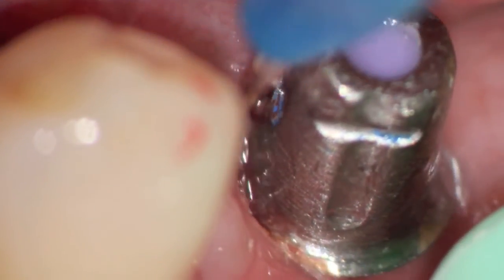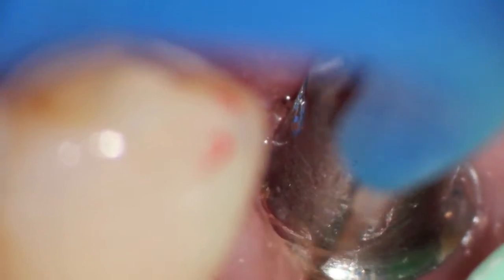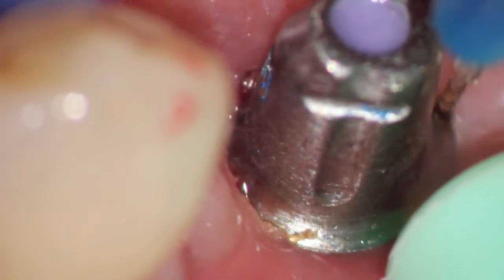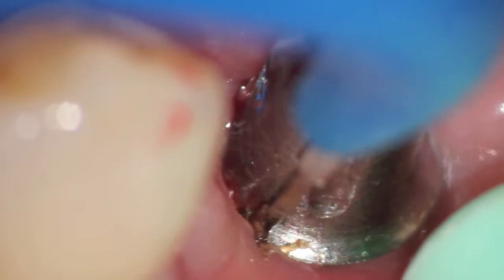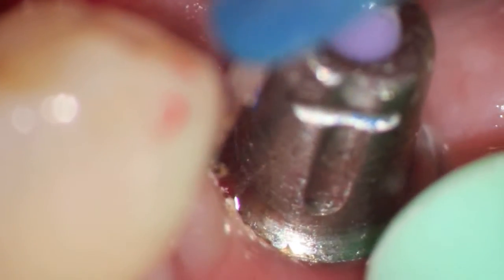This was done with only topical, and we're going to be able to remove enough tissue that we can finally seat the crown, which up until this time was not able to be seated fully. You can notice there's no interaction with the metal from the implants, and we are able to remove, in a bloodless field, the tissue allowing for the full seating of the crown to be done.